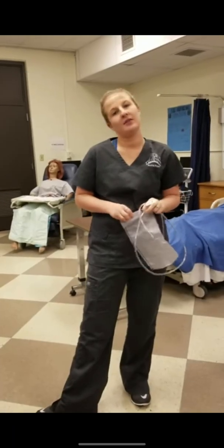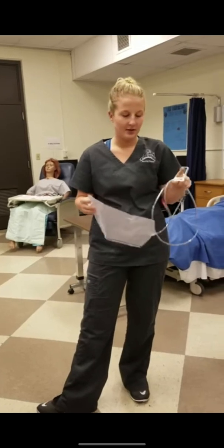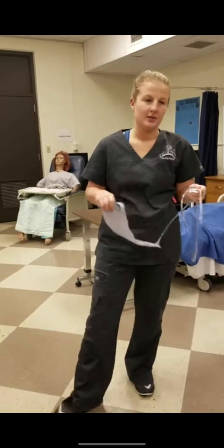I am a first semester nursing student. It is November 3rd, 2016 at 12 o'clock in the afternoon and I'm going to demonstrate how to insert an enema and remove it.